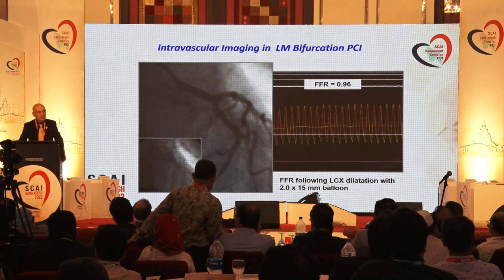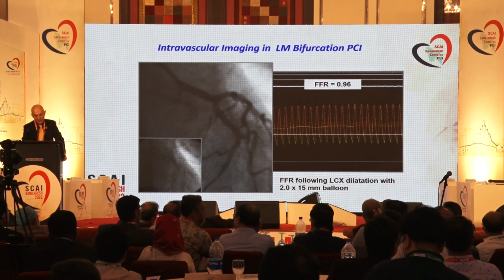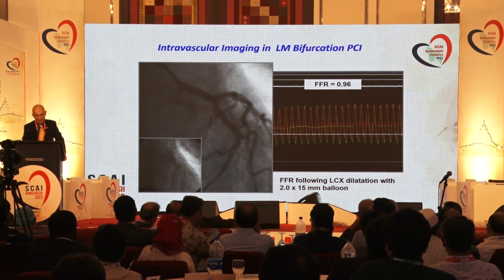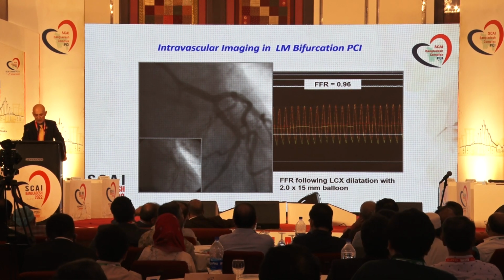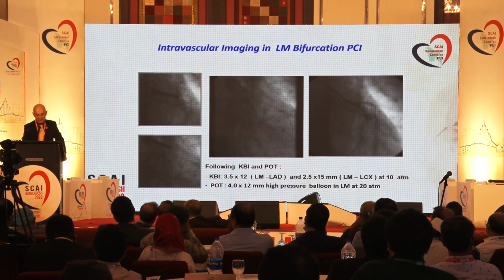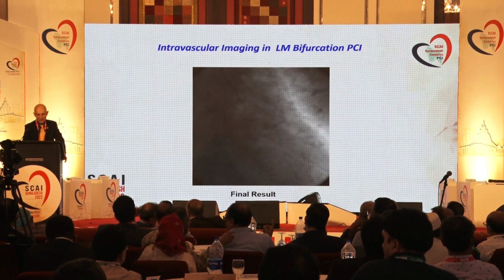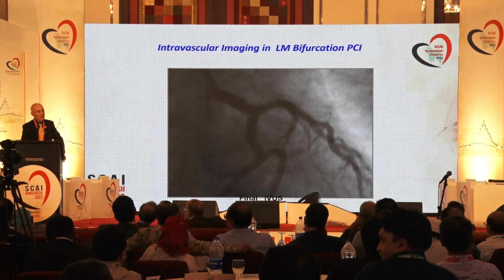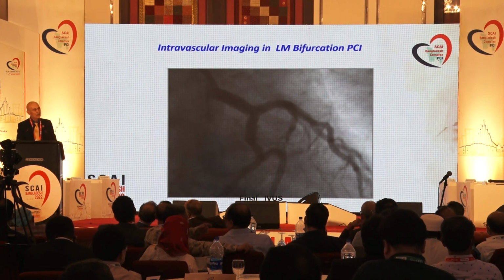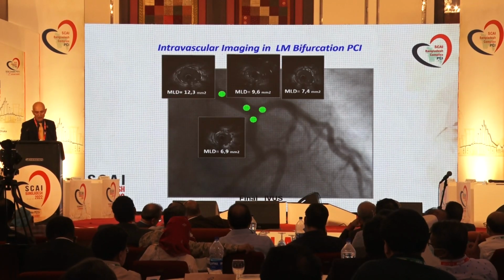And you have one minute left. Yes, and this was the result after balloon inflation. The ostium of the circumflex seemed very good and was confirmed by FFR, and this was the final result because we stopped here and we did IVUS, and IVUS was showing that the result was excellent. So bailout is not only stenting, bailout can also be done by balloon, as you can see in this case, very simple. Thank you very much for that.